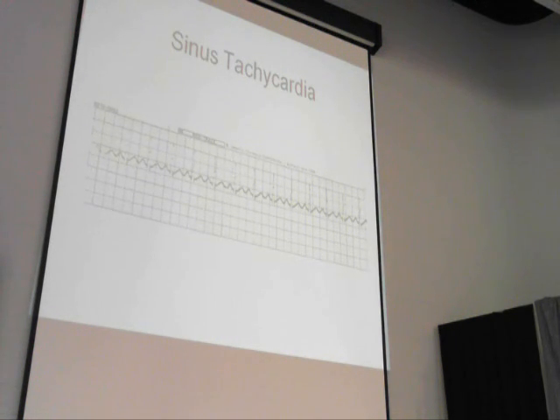What would be some drugs that somebody might be prescribed to slow the heart down? Calcium channel blockers, beta blockers. I think we talked about it just a little bit, but sinus tachycardia, all the pieces are there. It's all the descriptions of the sinus variations, just fast. Do you remember we talked about SVT?